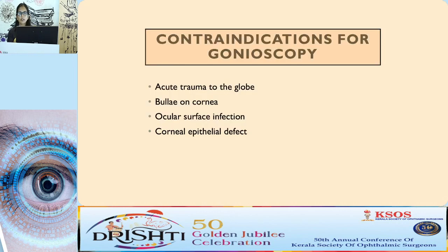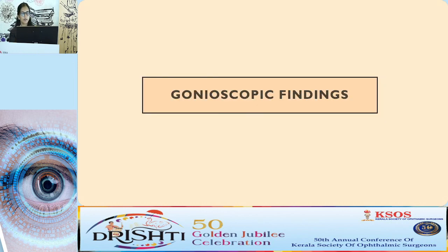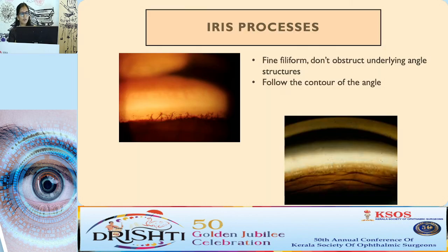What are the contraindications for gonioscopy? If there is acute trauma to the globe, bullae, ocular surface infection and epithelial defect. There are some of the gonioscopic findings.